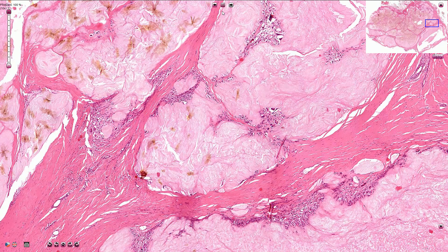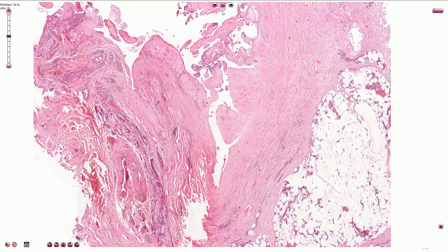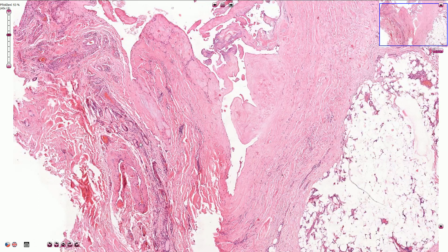I really recommend watching his video. This is another slide with a gout tophus in the soft tissue around the elbow. All of these amorphous nodules are uric acid deposits.